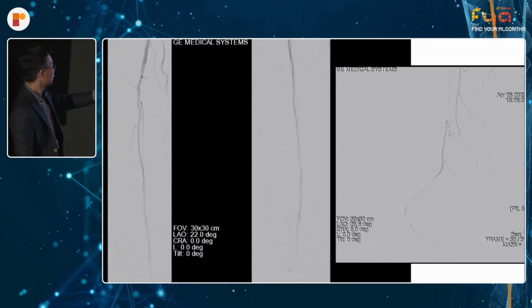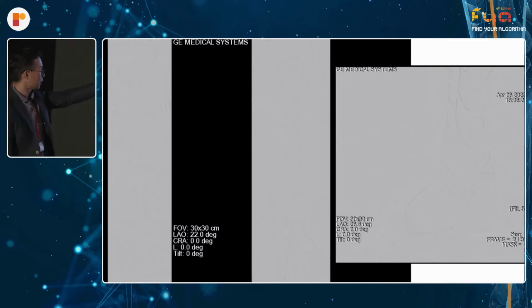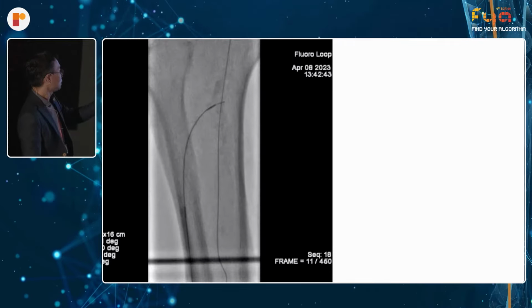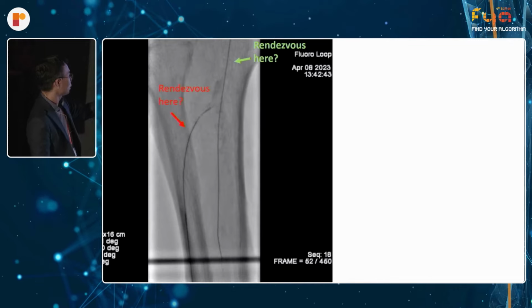Yes. Okay, so what you do is, there's a flush occlusion of the tibial artery. You don't know where you're at, so you need to go retrograde. This is a peroneal artery, got a nice distal target there. And the only thing I would say in this kind of situation, again, is that there is a discussion later on as to whether you rendezvous there or you rendezvous here.